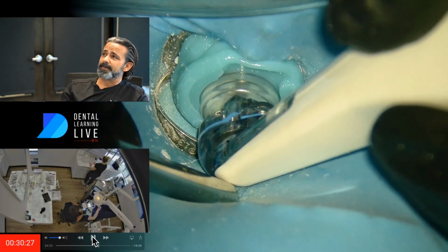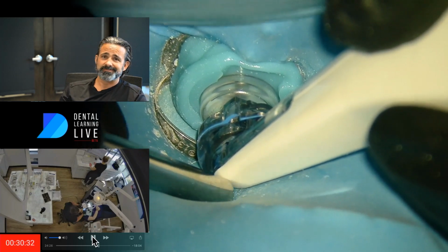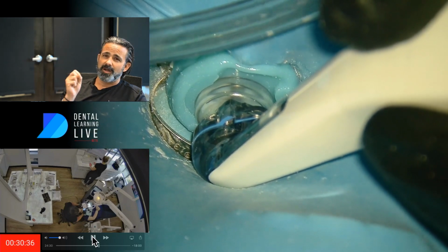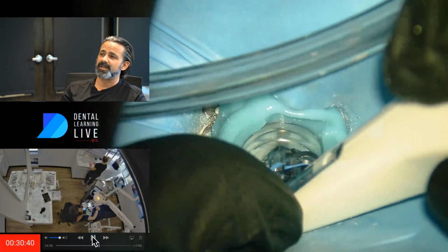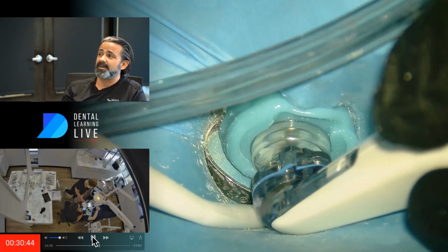And so at the top of the screen, like I said, you can watch what's coming through the tubing. If that's interesting to you, there it goes. You'll start seeing now I'm actually perceiving little poofs of heme, and so I know I'm into that apical third area or isthmus area.